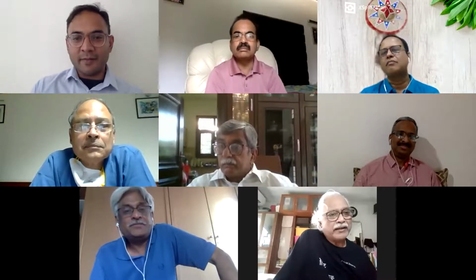That's my approach. Let's hear what Dr. Pujari says. No, I wanted to say the same thing. Quadrigeminal cyst fenestration is much easier to do from supratentorial. Sometimes you can do it even through a lateral ventricle, if you do not have a very dilated foramen of Monro. I have a couple of cases I have done even through the lateral ventricle, because they are bulging into one occipital horn so much that you can very easily get through there. There's hardly any brain in between.